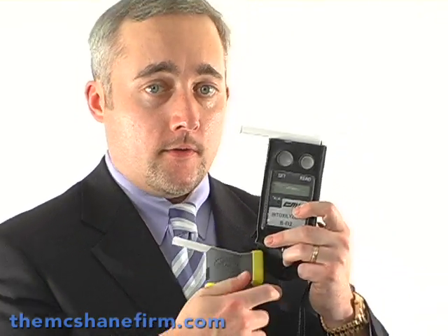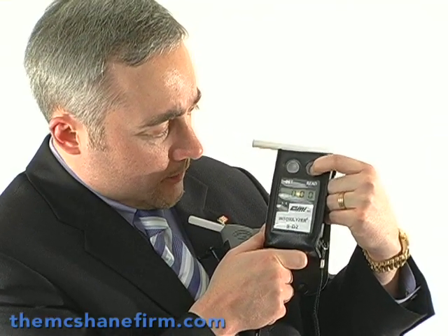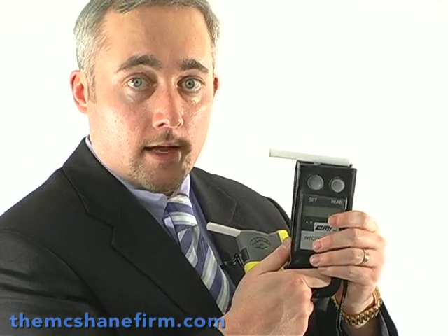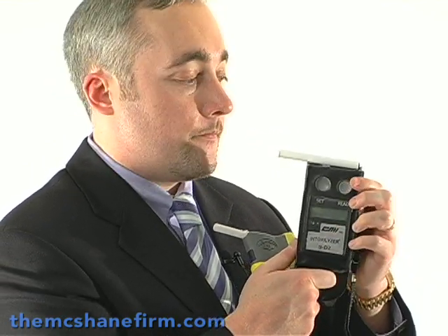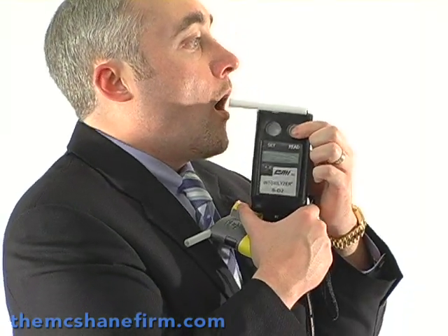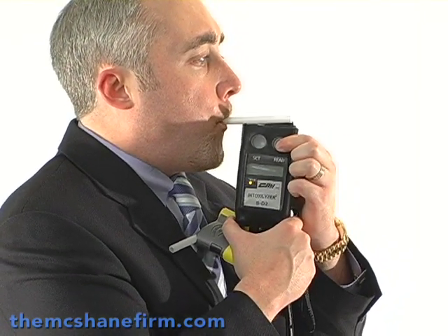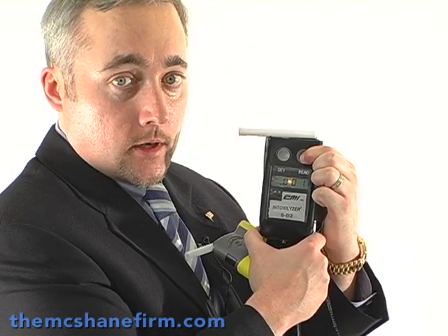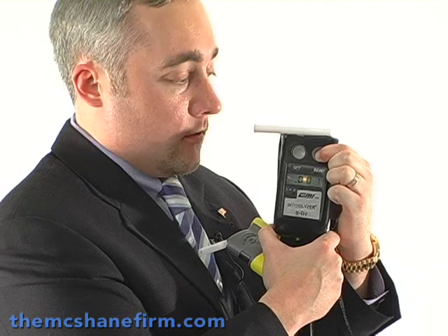It comes up and it shows no alcohol. The next device, the older device, is the SD2. I'm going to hit the read button and you're going to see it comes up with triple zeros. I'm going to set it again and breathe into this device to show that I have a zero BAC. As you can see, it's still a zero BAC.